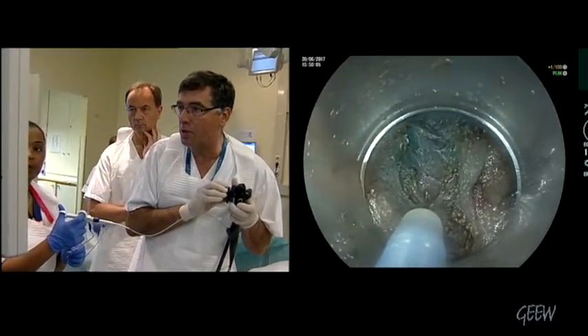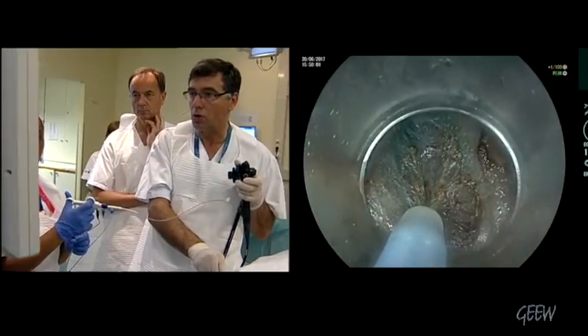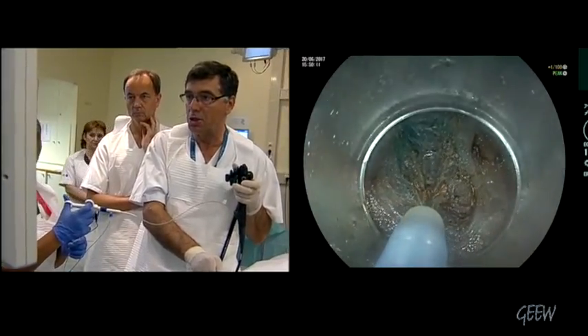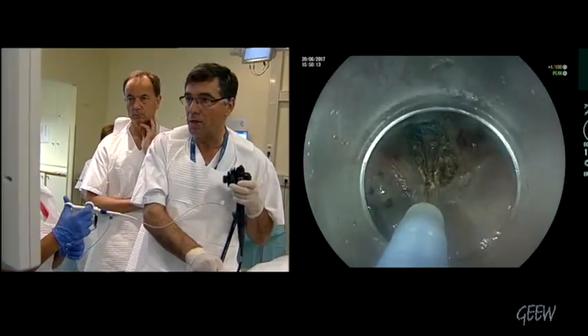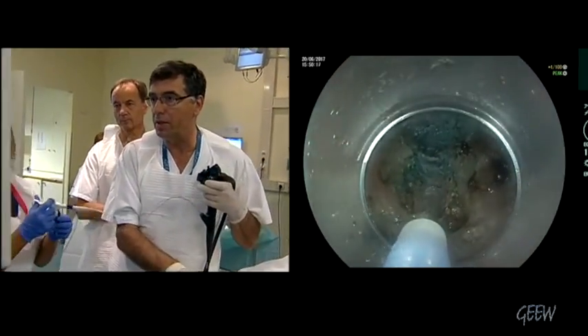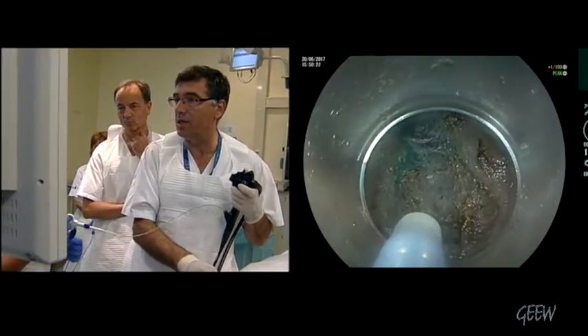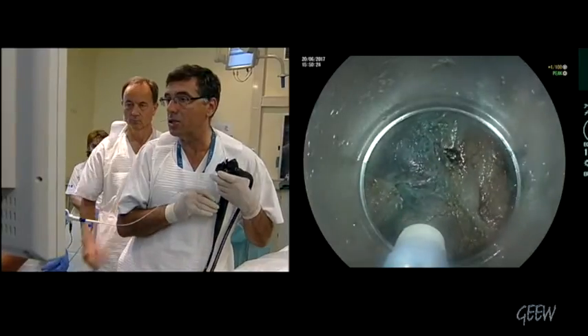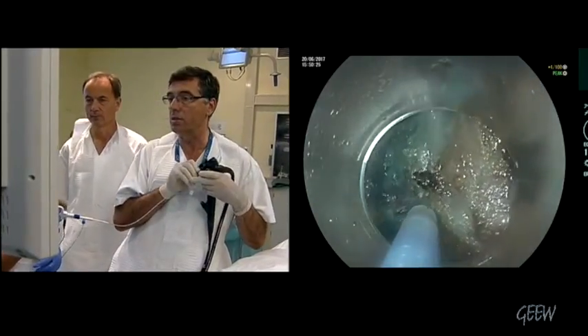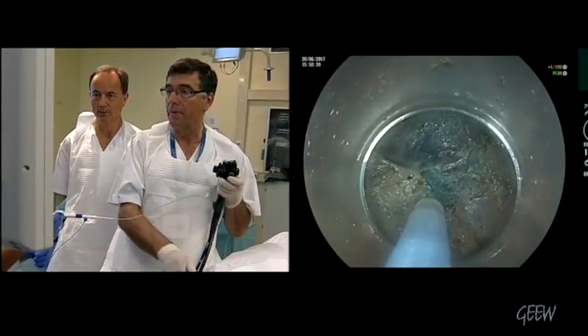We're not going all the way until we see the peritoneum. I go very slowly. Do you want to see the yellow peritoneum, or how deep are you going? There is still serosa in between — you can see there is still serosa only. The pyloric arch is here; it's cut. This is the difference from the esophagus, where we have no serosa.